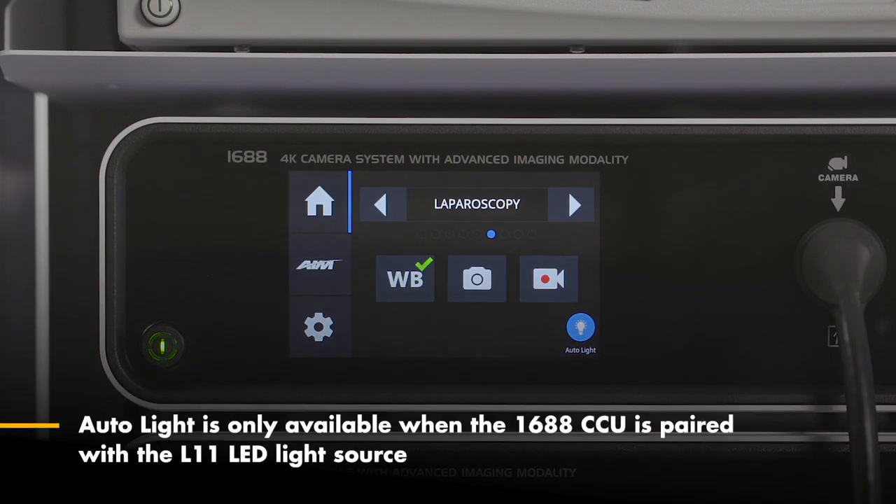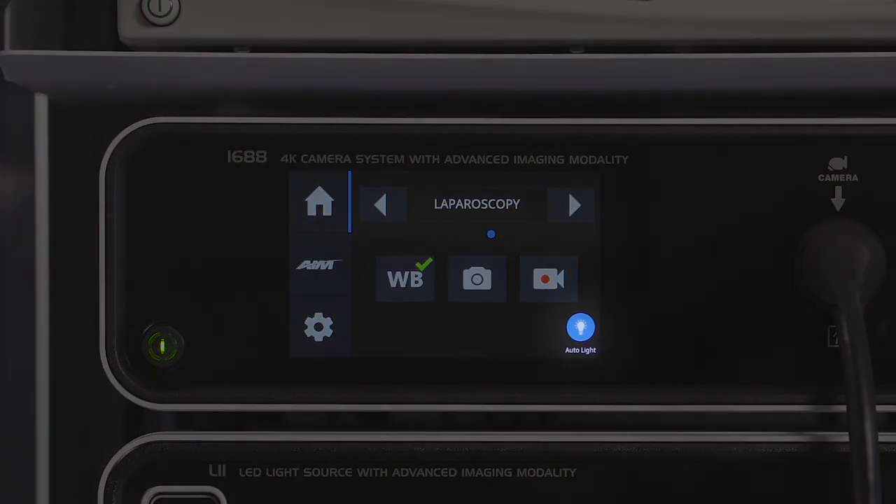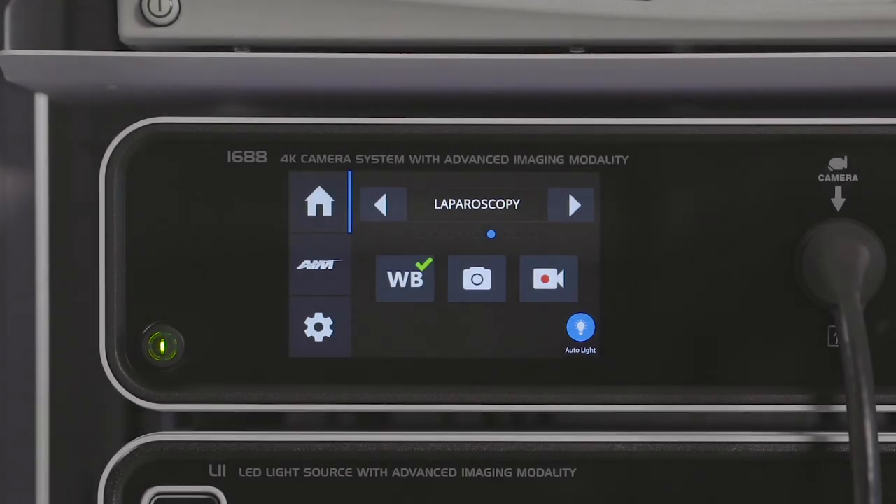Autolite is only available when the 1688 camera control unit is paired with the L11 LED light source. When on, the Autolite icon will be blue. The light source automatically adjusts to the intensity needed for optimal brightness. You will not be able to manually adjust the light source when Autolite is on.